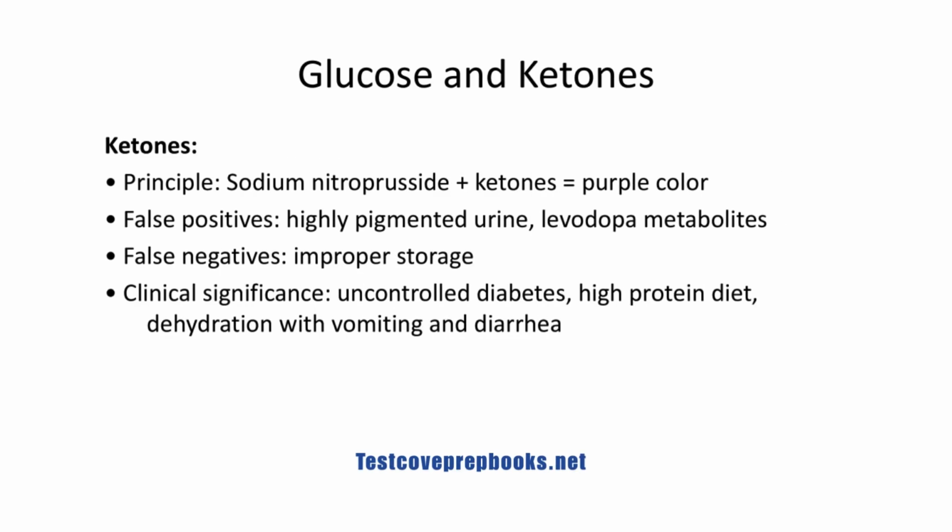Ketone detection is based on sodium nitroprusside reacting with ketones to form a purple color. False positives may be seen with highly pigmented urine or levodopa metabolites. False negatives can occur with improper storage. Ketones are clinically significant in uncontrolled diabetes, high-protein diets, and dehydration with vomiting or diarrhea.